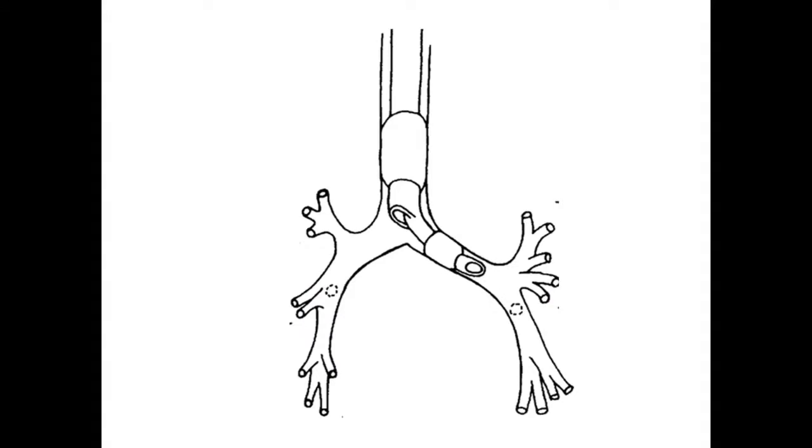Endobronchial blocker placement can be used in lieu of a double-lumen endotracheal tube shown here as a means for single-lung ventilation. Single-lung ventilation is used for various indications, including isolation of the lung to prevent contamination of contents from the other lung, control of distribution of ventilation for thoracic surgical procedures, or unilateral whole-lung lavage. In the critical care setting, it is most commonly used for lung isolation for massive hemoptysis.